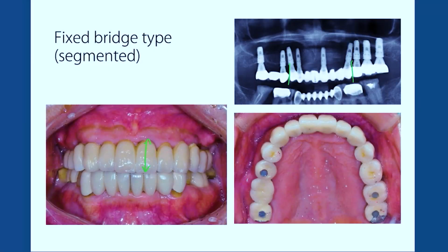When fabricating prosthesis, you do not do 14 teeth or the entire arch at the same time. If the full arch can be divided into 3 and restored, then it will be much less stressful for the surgeon.